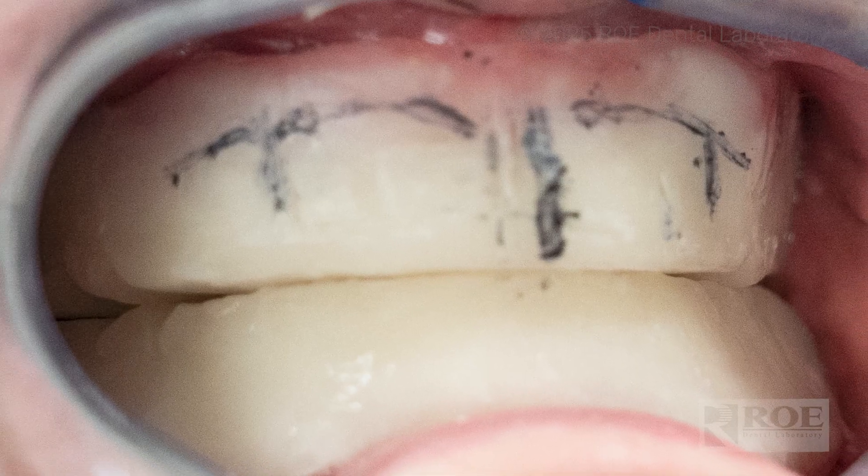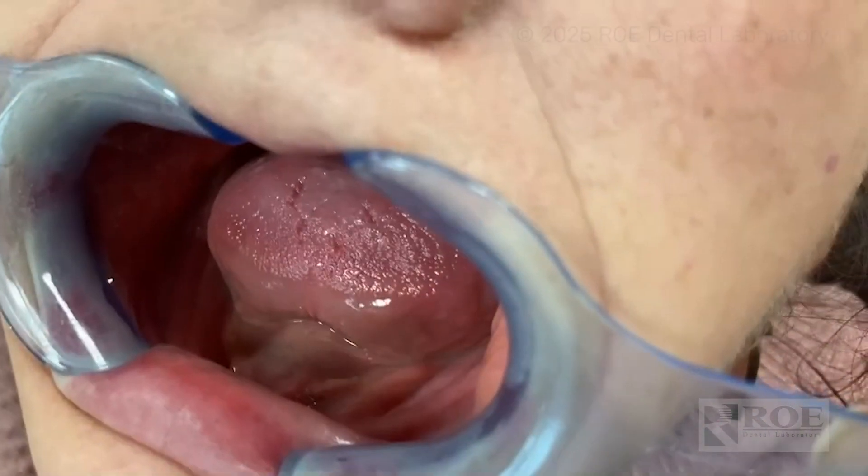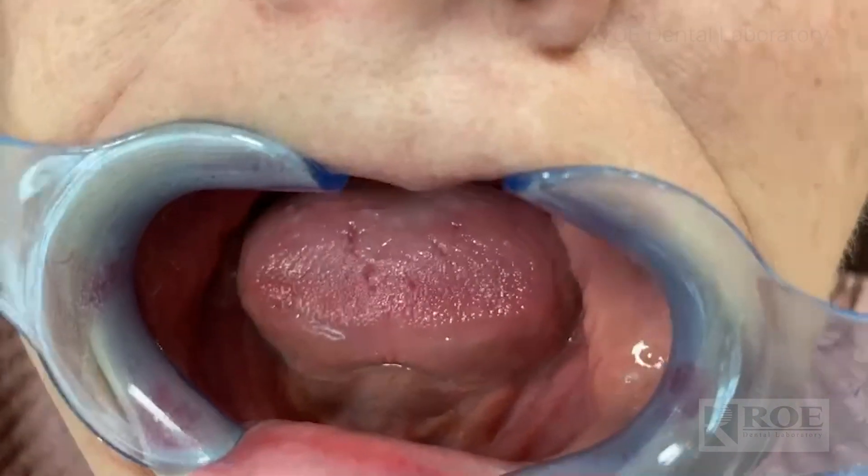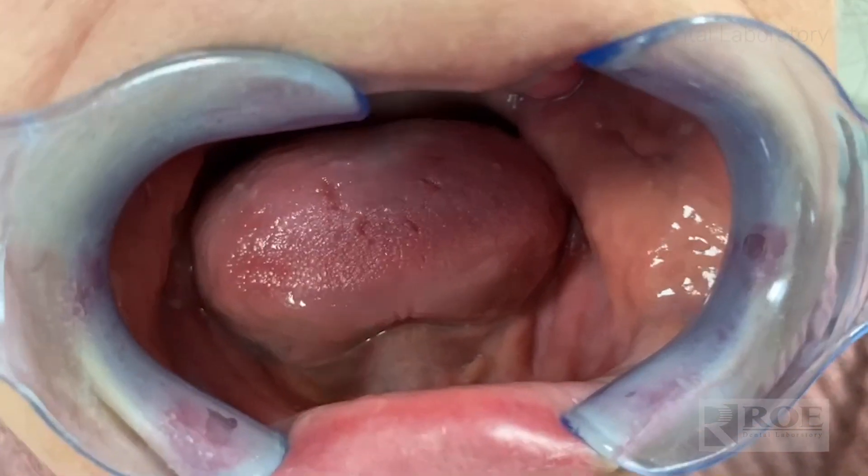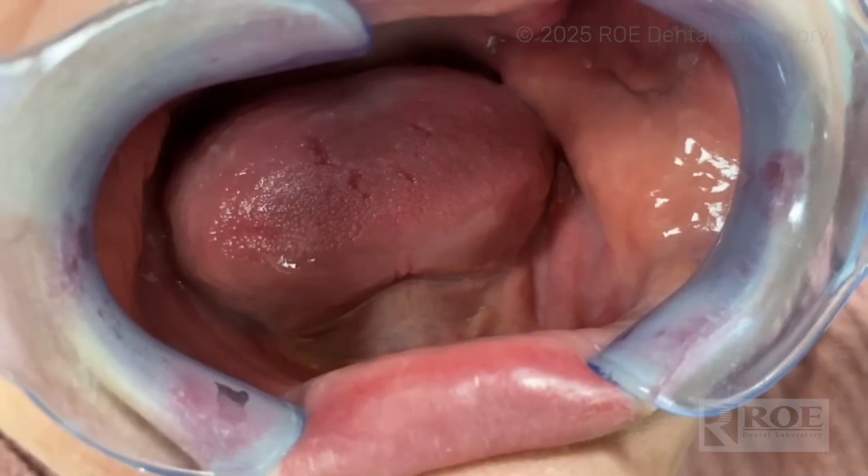Go ahead and make those markings and take your photos. Some doctors ask me when they're taking edentulous intraoral scans, what about capturing the vestibule? Sometimes that's a little bit tricky. My suggestion is you can actually take a wash inside the bite block if you'd like for a secondary impression almost. Do a little bit of border molding or include any other details you'd like to convey to us at the lab.